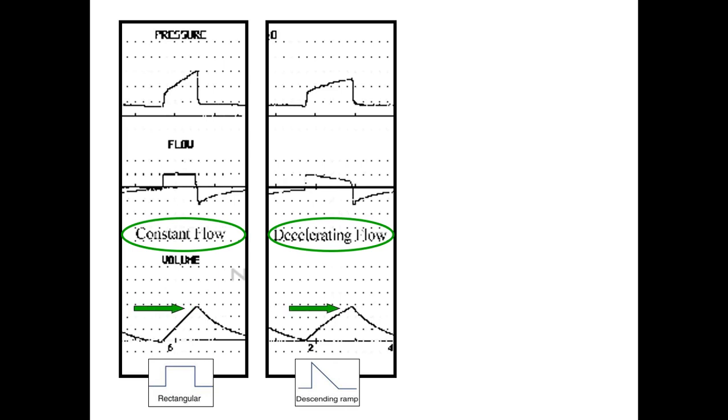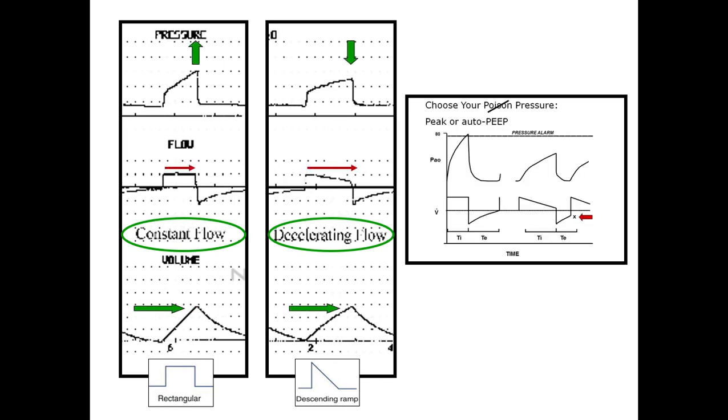So you're giving the same tidal volume, but you're delivering it over a longer period of time, and as a result, the peak pressure goes down and the machine stops beeping. And lots of times, that's fine. So I'm not telling you to never make that suggestion, but be aware of the consequence of it. Because while the beeping is stopping, if you take longer to push the breath in, you may not have enough time for that last breath to get out. And if that happens, you can develop auto-PEEP. So you've got to pick your poison.